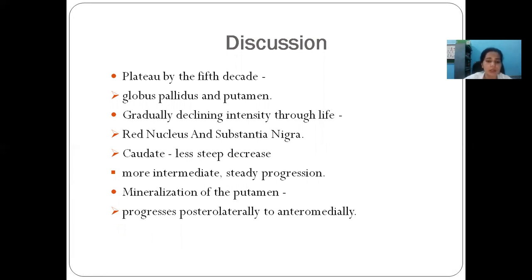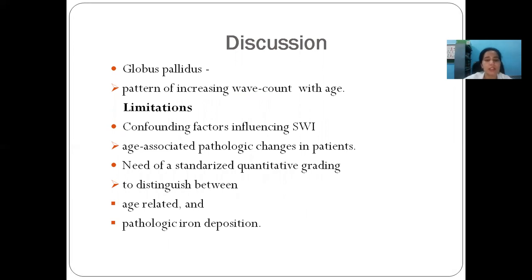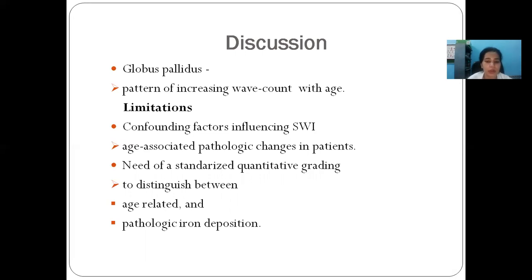Apart from that, the pattern of mineralization was noted in the putamen and globus pallidus, where the putamen showed progressive posterolateral to anteromedial progression of deposition with increasing age, and the globus pallidus showed increasing wave count with age. The limitation of our study was the confounding factors that included age-associated pathological changes in patients. Therefore, there is a need for a standardised quantitative grading system to distinguish between age-related and pathologic iron deposition.